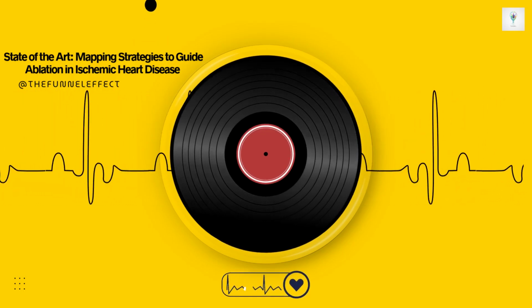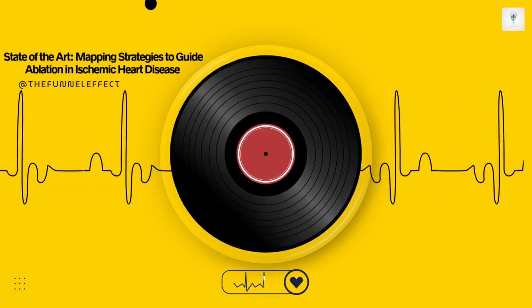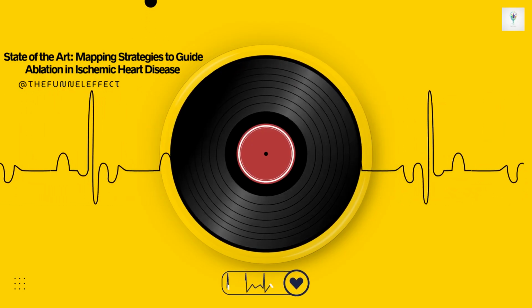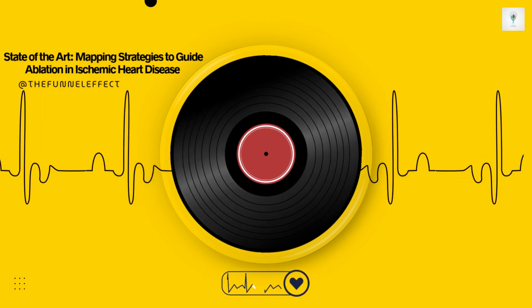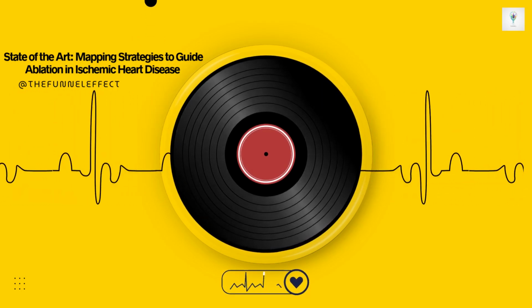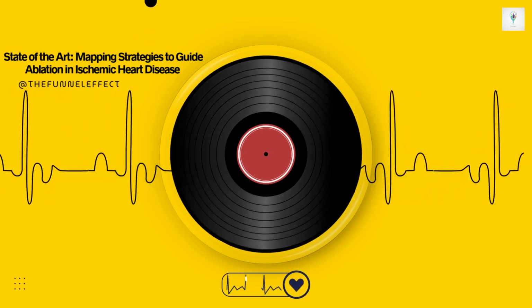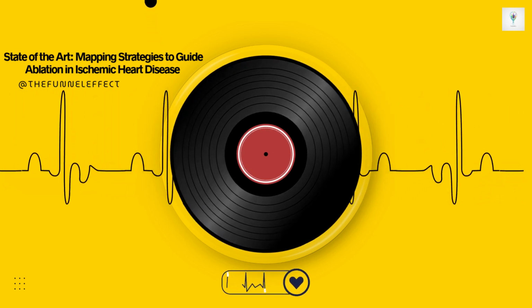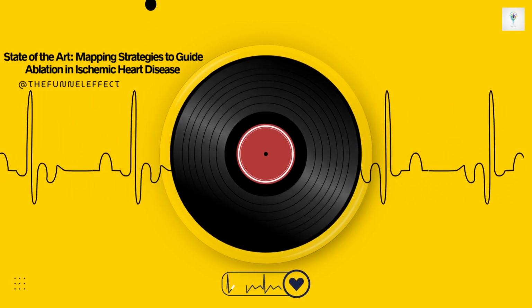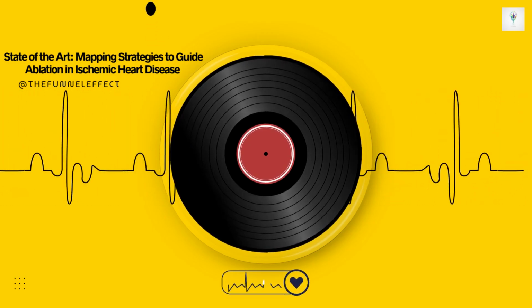If your catheter tip is truly located within the reentry circuit, your faster pacing will temporarily take over or capture the circuit. You're essentially speeding up the merry-go-round. When you stop pacing, the circuit immediately snaps back to its original speed, the native VTCL. This proves your pacing site was interacting directly with the circuit. Okay, so capturing it proves involvement, but how do you measure that interaction precisely? You mentioned the post-pacing interval, PPI.